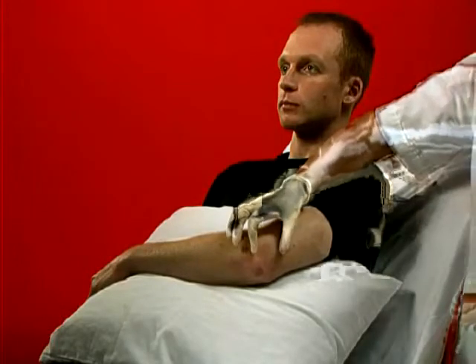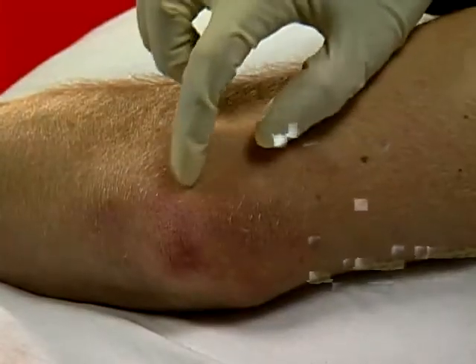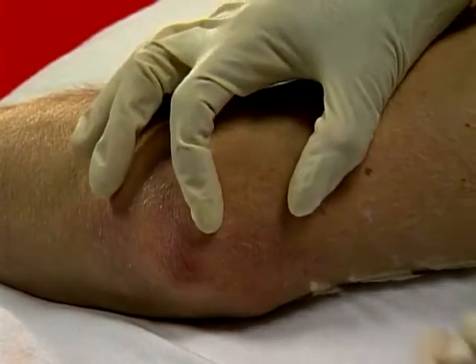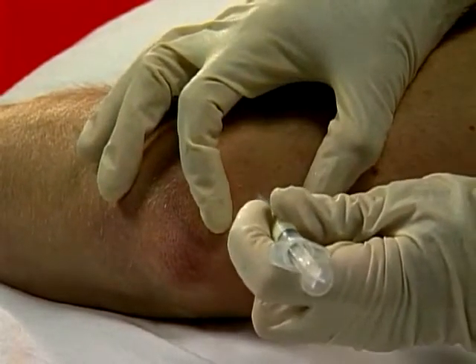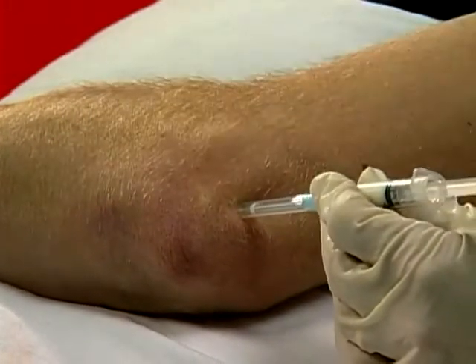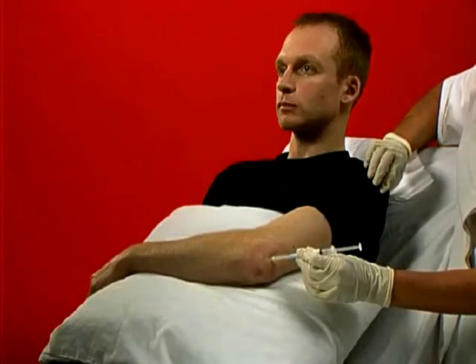There may be swelling at the posterior aspect of the elbow. Mark midpoint, clean and firmly stretch skin, and rapidly insert needle perpendicularly. Aspirate and deposit any excess fluid into containers, and then inject as a bolus.